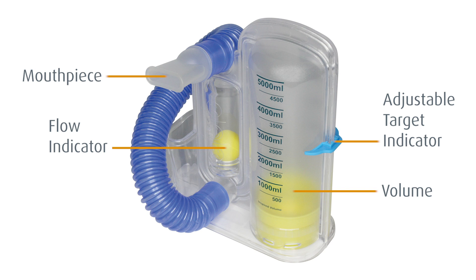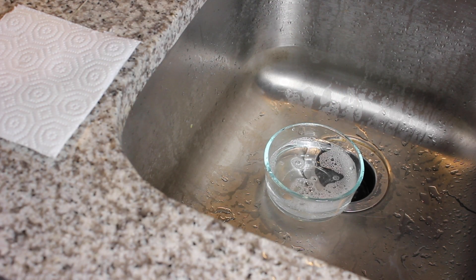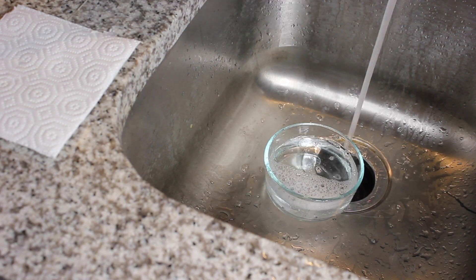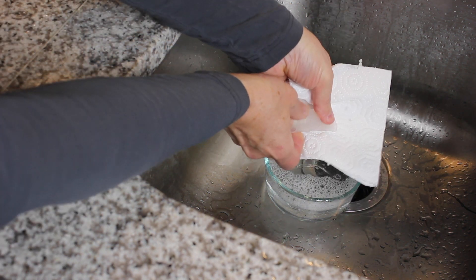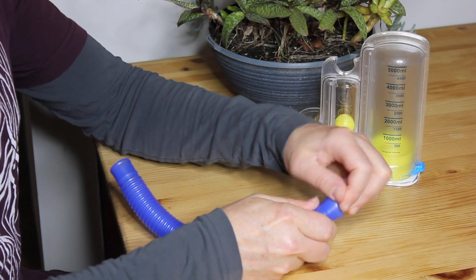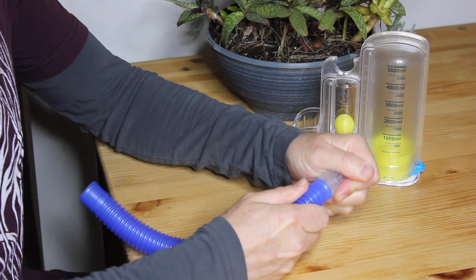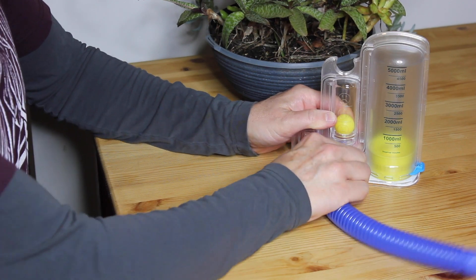Let's get set up to use your Sunset Spirometer for the first time. If you're at home, first clean the mouthpiece using soap and lukewarm water and dry fully with a clean cloth or paper towel. Ensure that the tubing is properly and firmly connected to the Spirometer port. Set the target indicator to your desired or prescribed volume level.